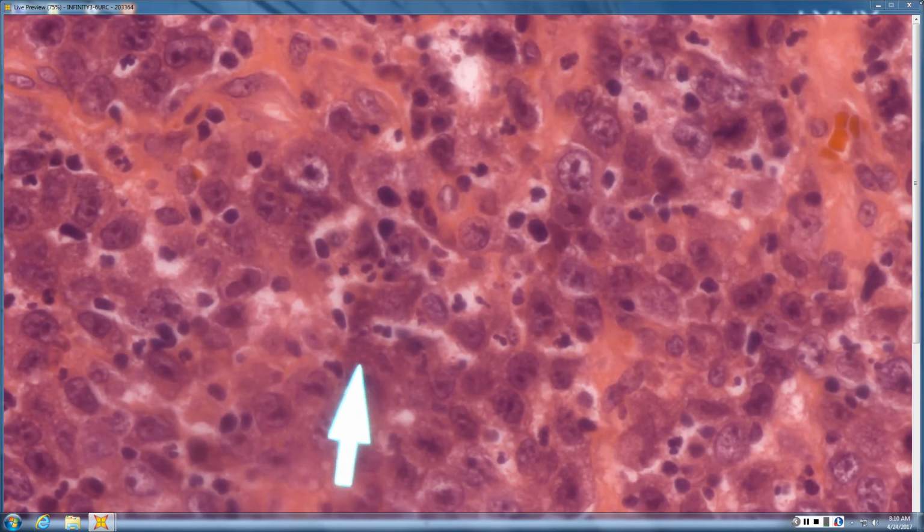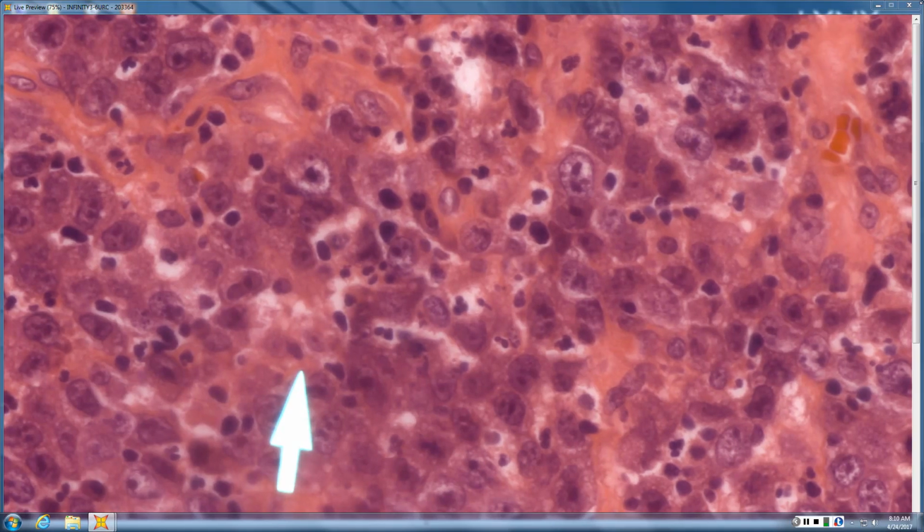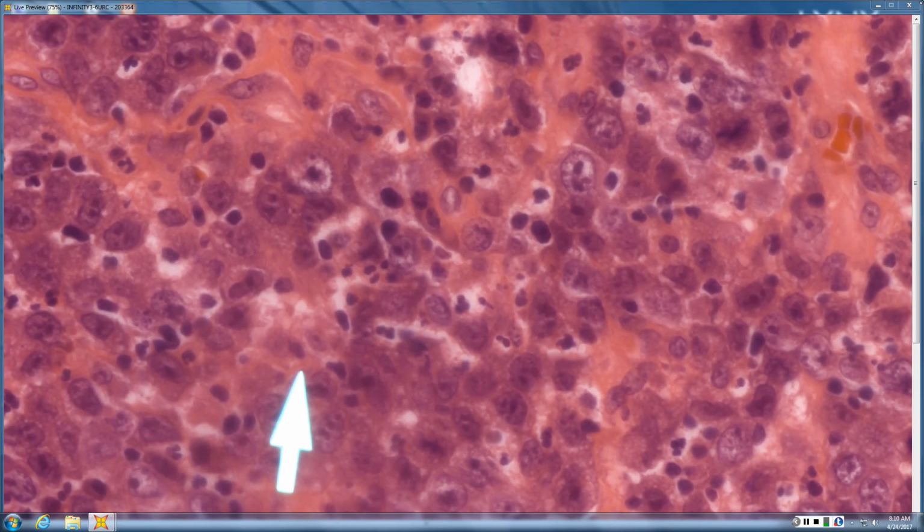Anaplastic large cell. More like an ALCL type nucleus, one that you might expect to be Ki-1 positive. So Ki-1 is CD30, same thing. Lots of markers have two names, just like someone's name might be William and Bill. Ki-1 is CD30, same thing, right?